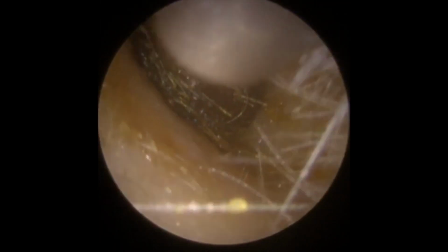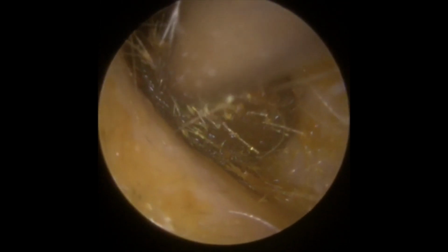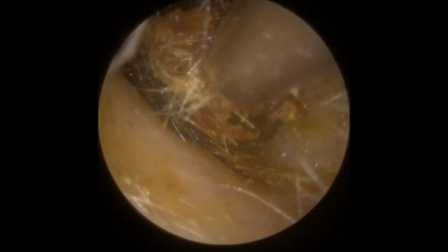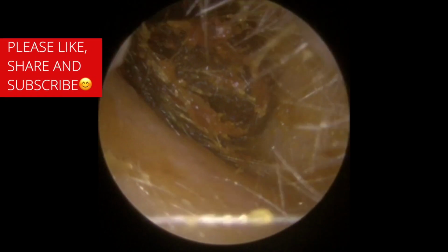Sometimes if you've got that angular piece at the front, because you can't get a good suction grip, you'll go in with a forceps, grab it and take it away. But as you can see with this one, we're just breaking the front end away here first of all. There we go. That should leave us a flatter surface to work with, which it does behind. So we're just going to maneuver this back and forth, see if we can wiggle it out.